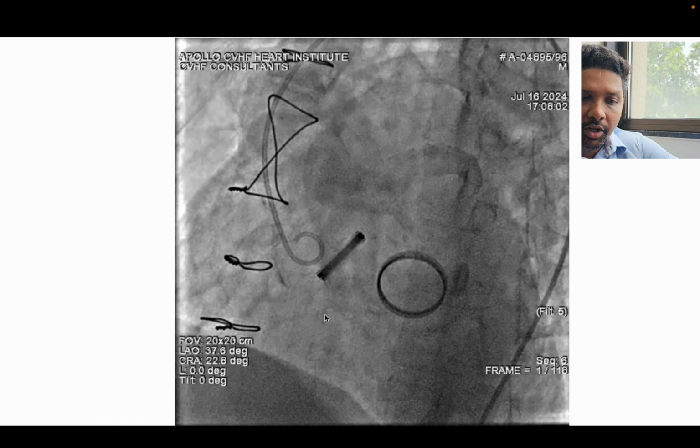While pushing this catheter also, the maneuver that I did was I pushed the catheter till the LV apex and then tried to remove the Safari wire, because the tendency of the catheter was to go oblique as the leak was oblique. Then I pushed another neurointervention catheter, a Striker catheter, into LV. I could have pushed here also a simple Flexor sheath, but I had Striker available. I just tried it this time. These are just 6 French catheters, which have larger inner lumen through which we can push larger devices. That was the whole point of putting these neurointervention catheters.